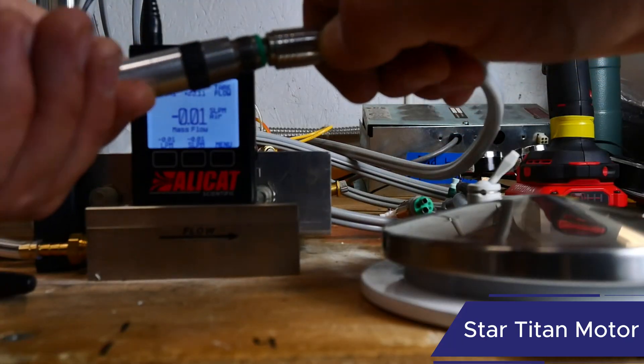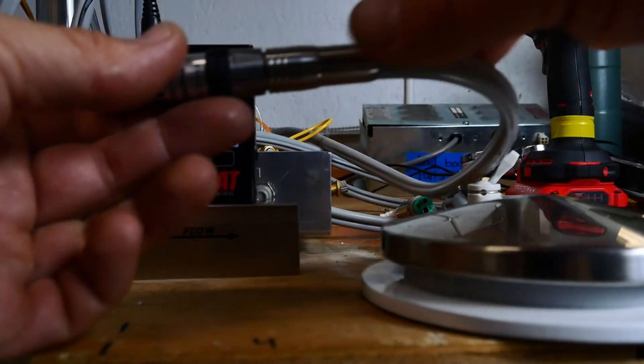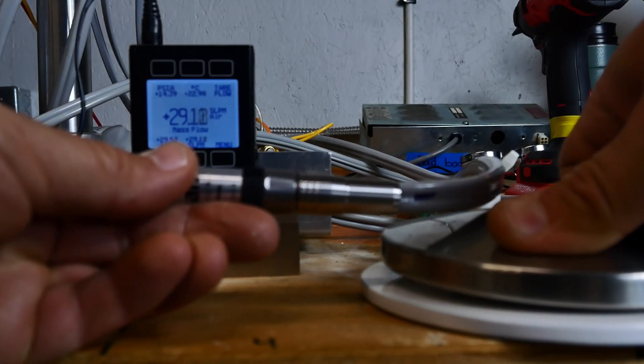Next is the Star Titan motor. That reads about 29 standard liters per minute.